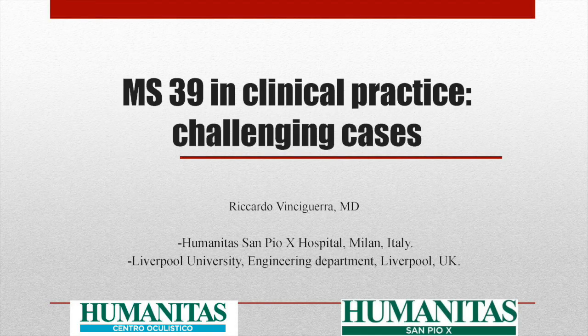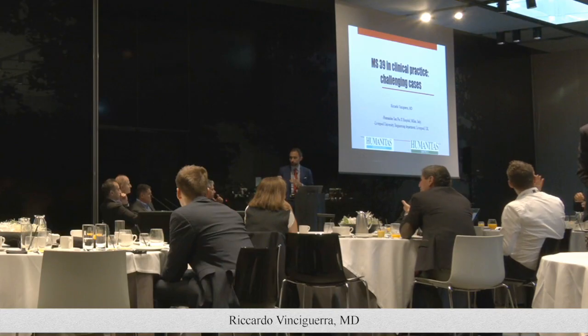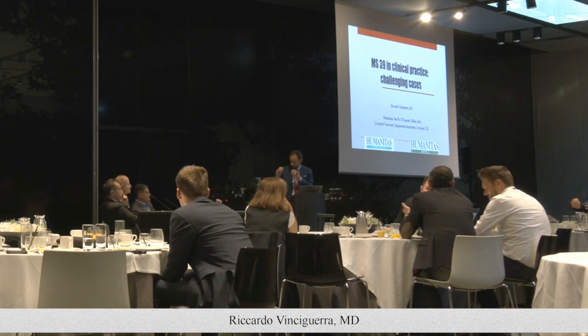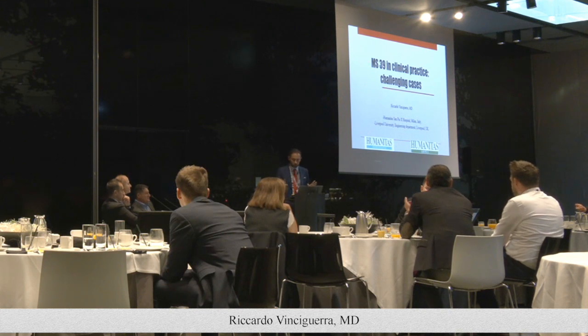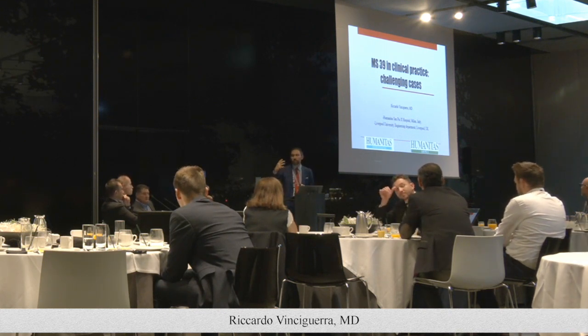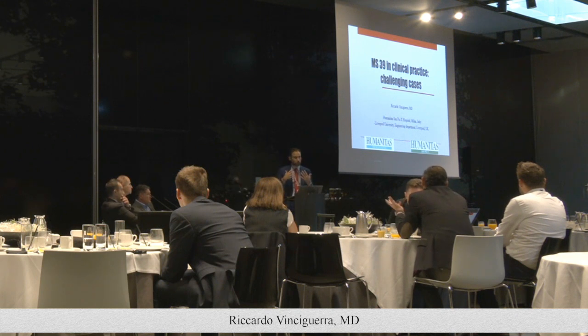Okay, so I decided to do this presentation in a slightly different way. It's not going to be slides and then discussion, but case, very quick discussion with each of you and even the audience. And then if we have more time, I have some slides at the end as a sum up.